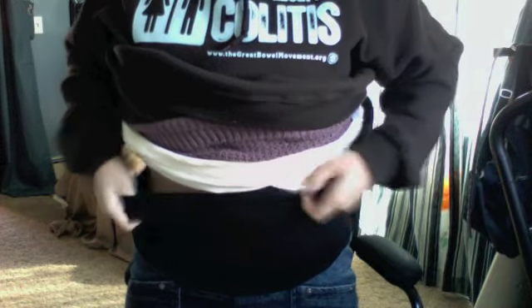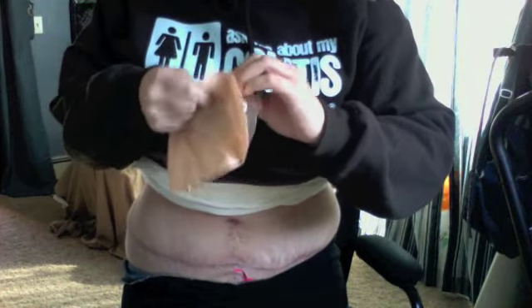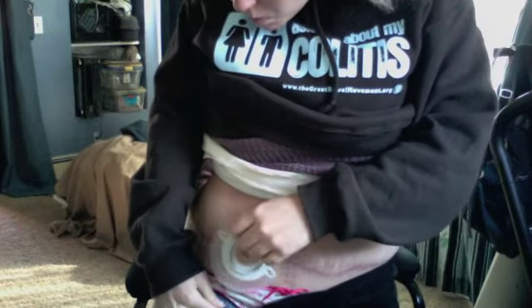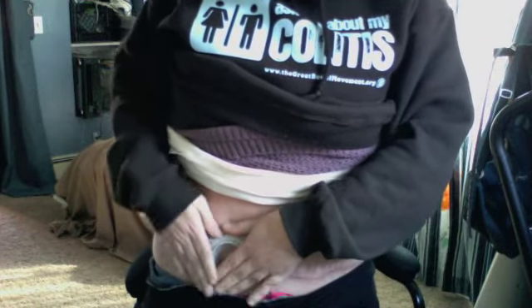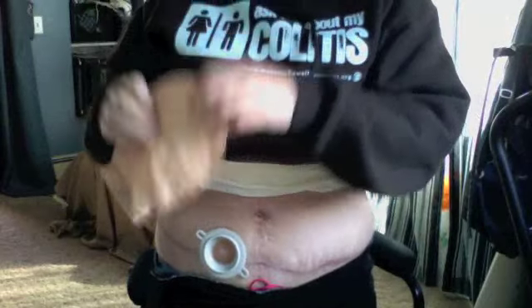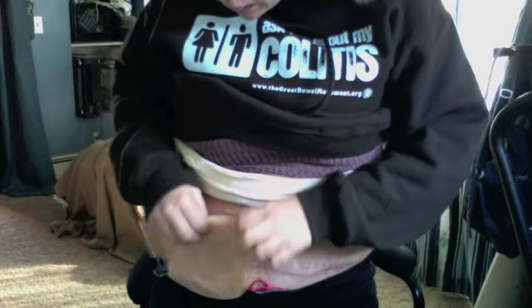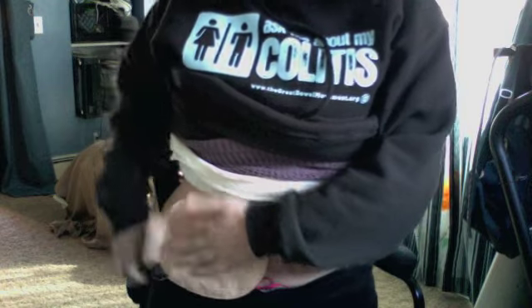I wonder how many people who don't have ostomies put ostomy bags on. Betcha it's not a lot. Okay, so let's say my ostomy used to be about here. Okay, that's where it used to be. So this is what I would do. Take my bag, clip it on, you can hear it snap, turn it, lock it, put my jeans over it.